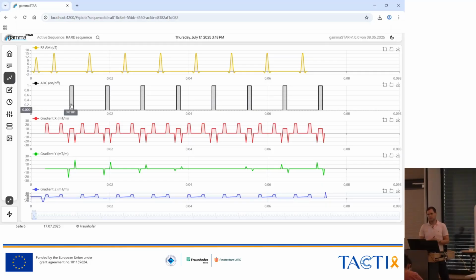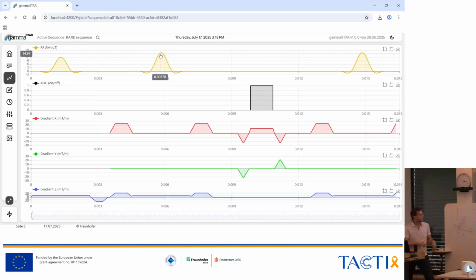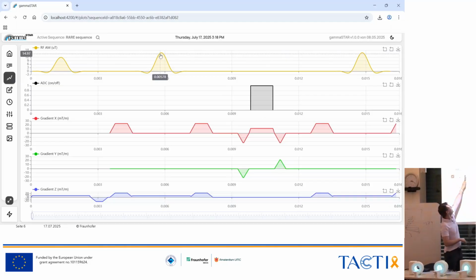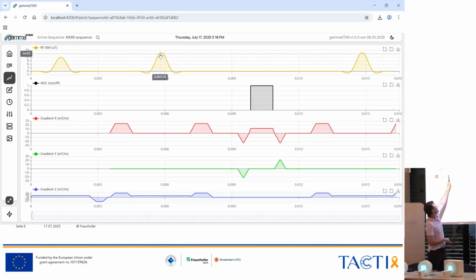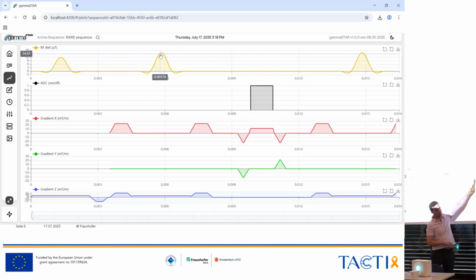There were some people thinking about how to accelerate that, and one way would be to work with spin echoes. I'm pretty sure that Matthias already introduced spin echoes. So we have a 90-degree excitation pulse. Then we use a spin echo to create an echo, which is exactly at the position at the same duration between here and here, where we have all these spins aligned again.